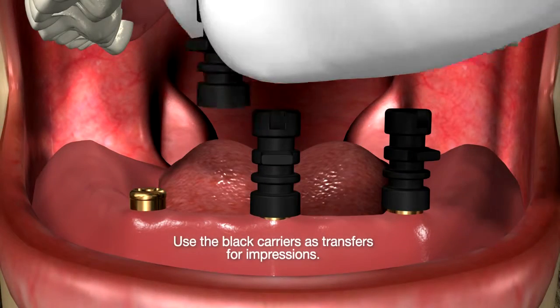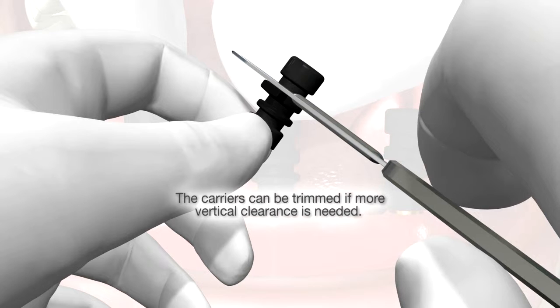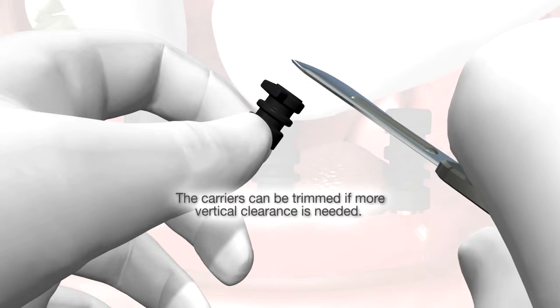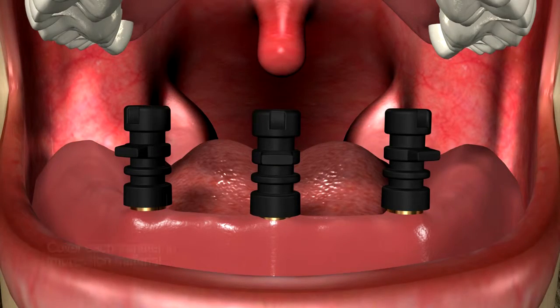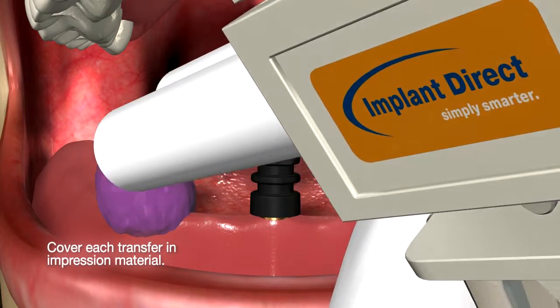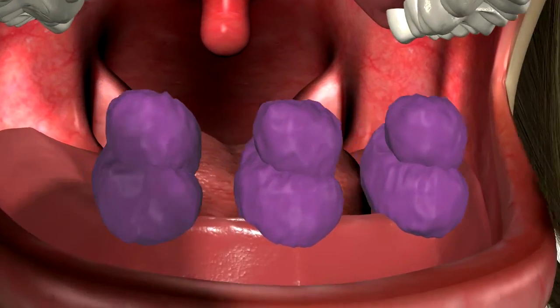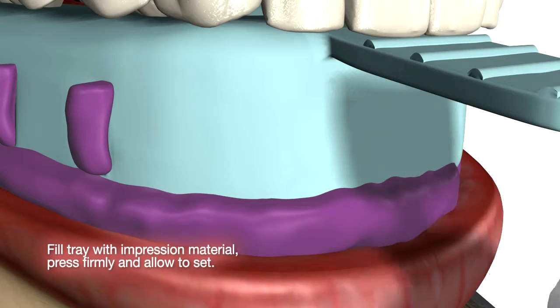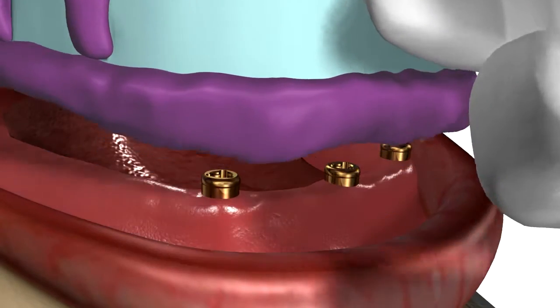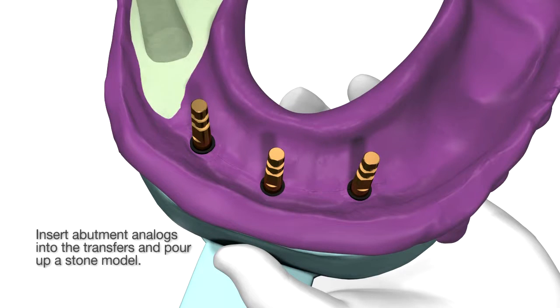Now you're ready to take your impression. Snap on the transfer that comes with the implant. If you want to cut it off to make it shorter, you can. Snap on your comfort caps. Now you put the abutment analog in the transfers. Pour the working cast.